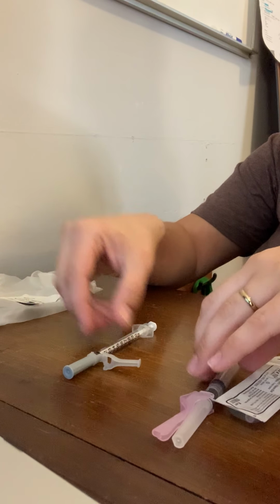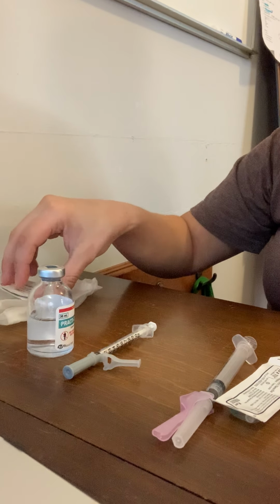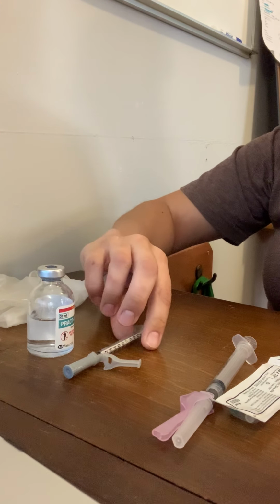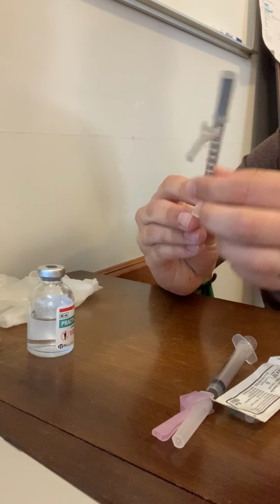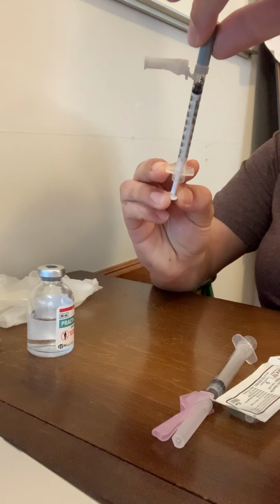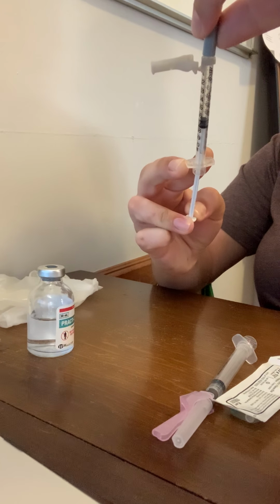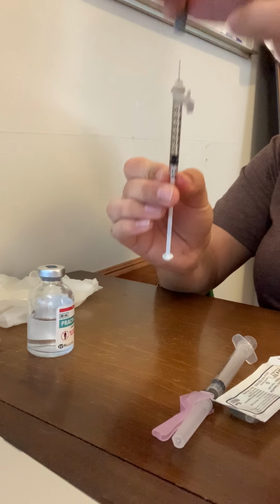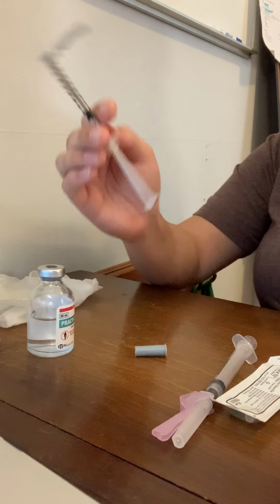I will do my heparin. So I am going to cleanse my vial. I will draw up 0.8 ml of air into my syringe.